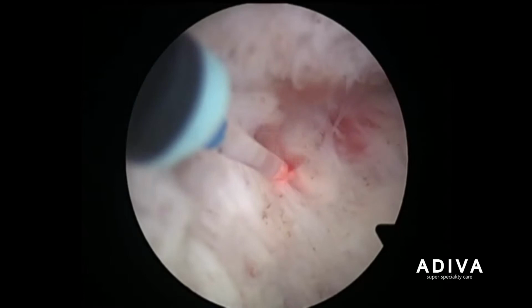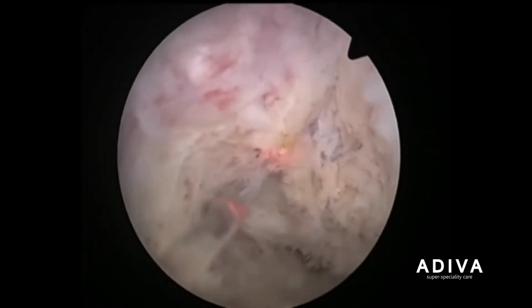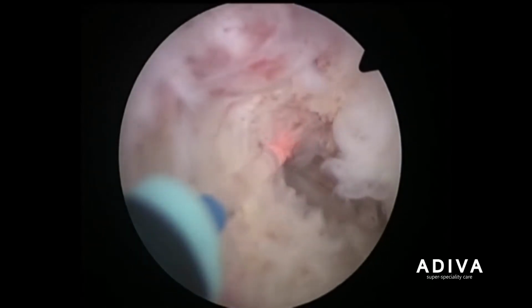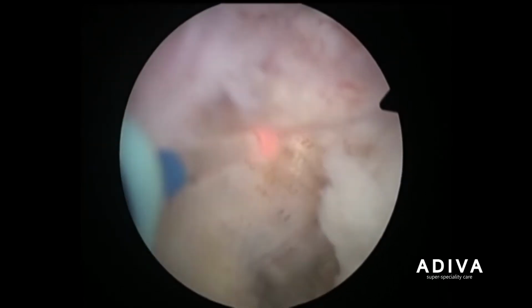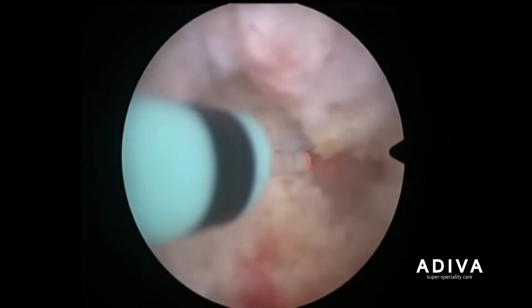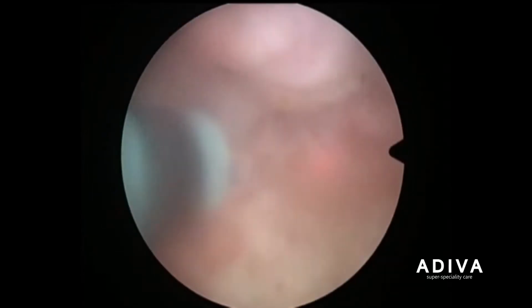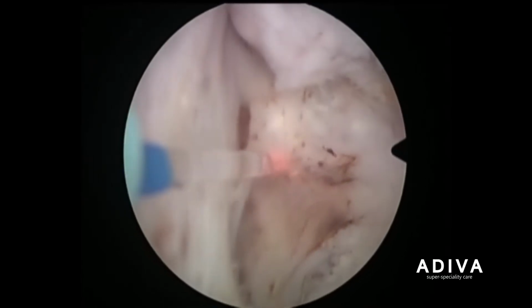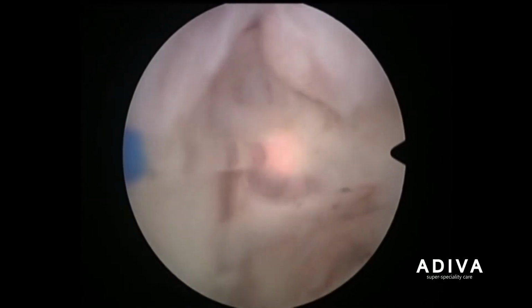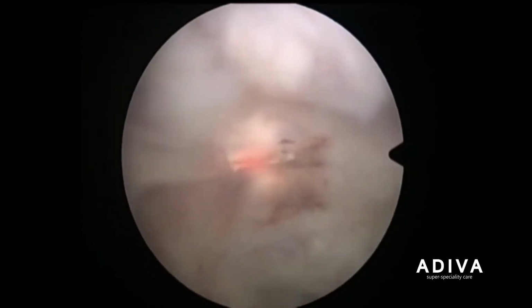This is the coagulation of the bleeder. You can see the fiber is kept a little away and is very well coagulated. If you see very carefully, you will find that we are maintaining a particular plane. It is something like we are trying to take out the pulp of the orange fruit and keeping the skin behind. The peel of the orange is the one which you can see is on the outer aspect, and the laser is completely enucleating the pulp.